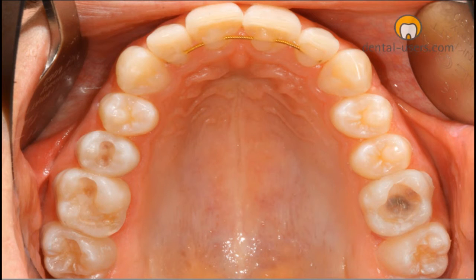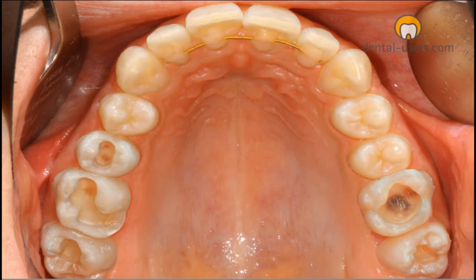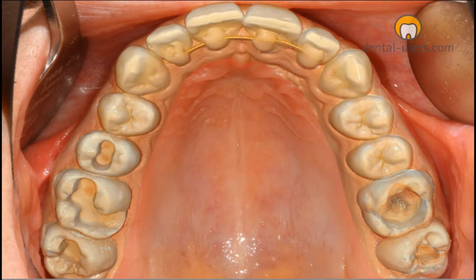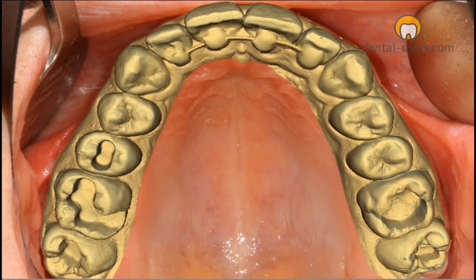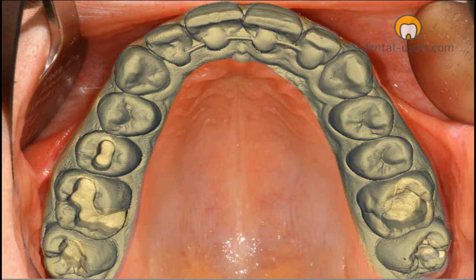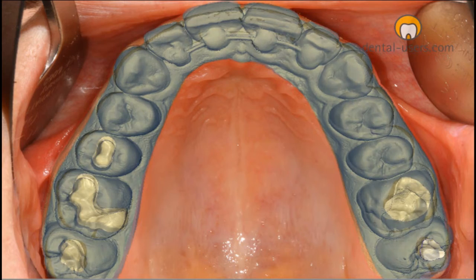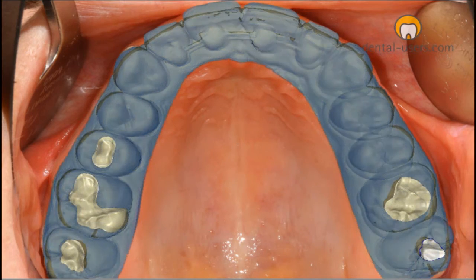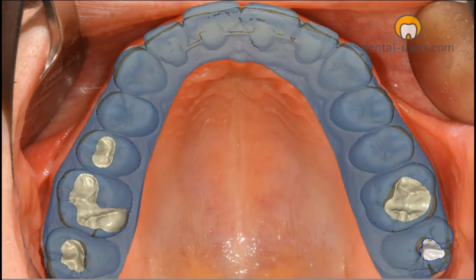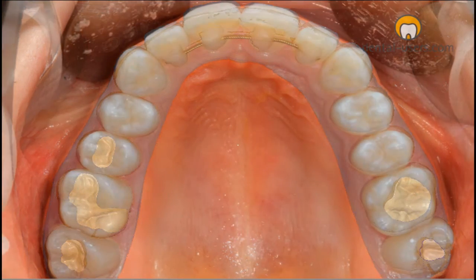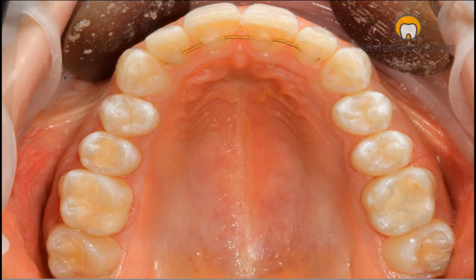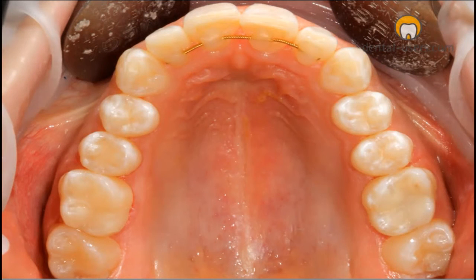The situation before, moving on to the preparation, moving on to the scan, to the construction, and completion.